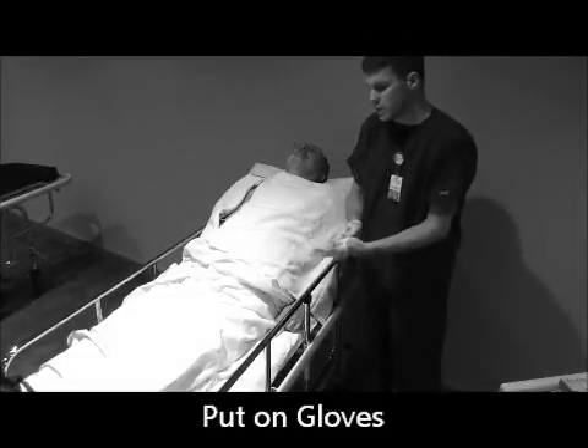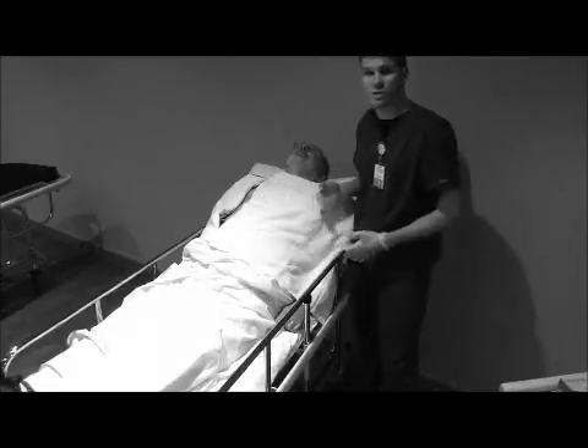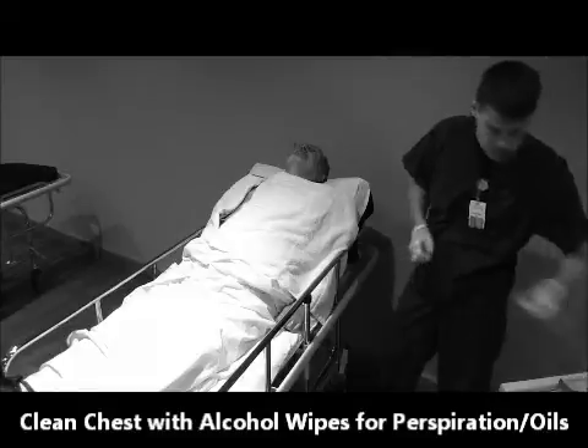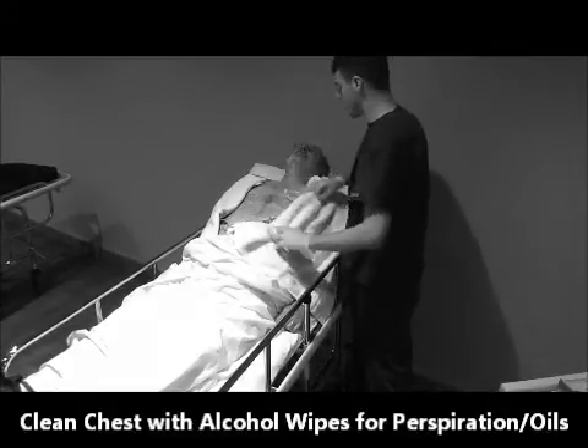There are ten different electrodes that go on the body: two on the feet, two on the hands, and six right across the chest. You usually start with the ones right across the chest, and we'll begin right here.